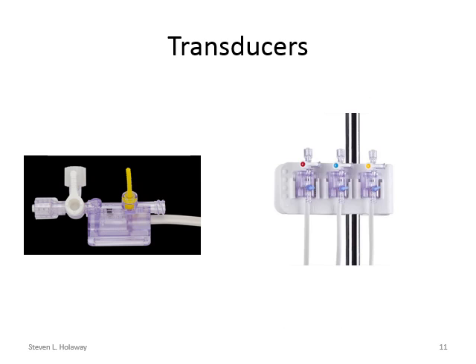You can see here, this is a picture of a transducer. This is what I was talking about when I talked about a pigtail. This is just a little rubber-type process connected to a valve. If you want to open it, you just basically pull this out, and you open the valve and allow fluid to flow freely through there.